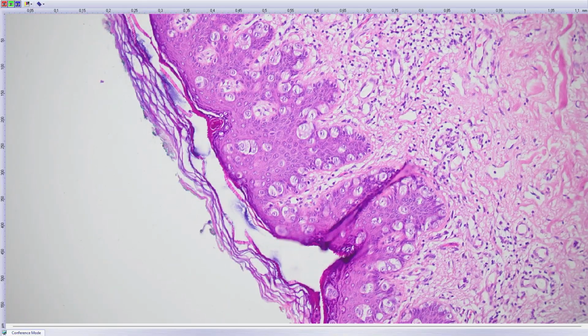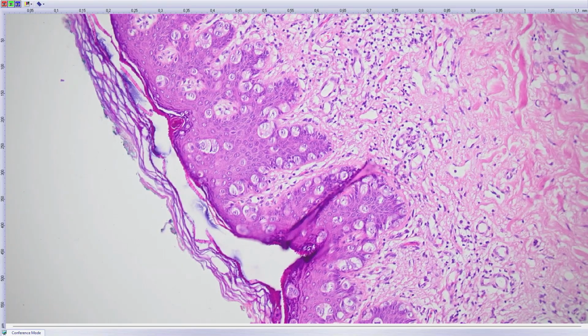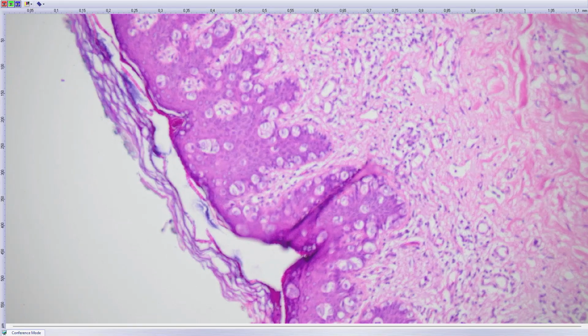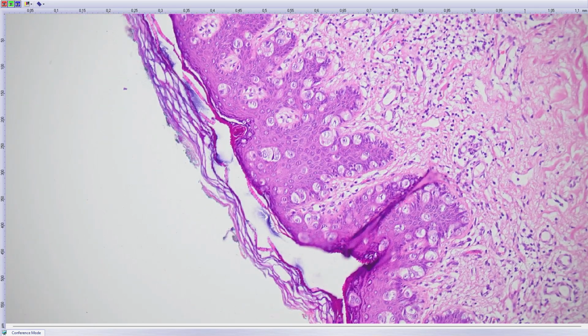And if you are not sure, you can do immunohistochemistry. The cells were negative for melanoma markers, positive for epithelial markers, including cytokeratin 7. And it's a female, and it's in the axilla. So we stain for estrogen, progesterone receptors, gross cystic disease fluid protein, and some other breast cancer markers. Everything was positive. So it's extramammary Paget's disease.